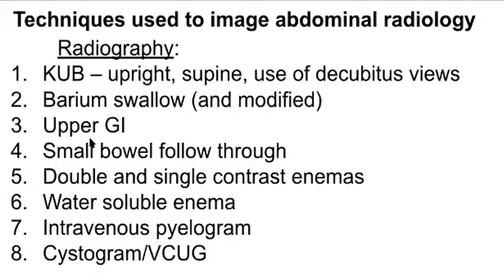Here are the images with the patient laying down in the right anterior oblique position, swallowing to look for primary and appropriate secondary peristalsis. Here we see a small hiatal hernia with part of the stomach herniating up into the thoracic cavity. This covers the modified barium swallow, which evaluates the swallow mechanism, and the barium swallow, also known as esophagram, which evaluates the structure and function of the esophagus.